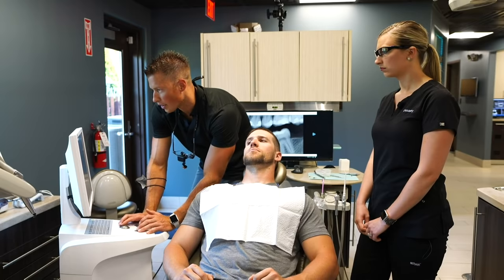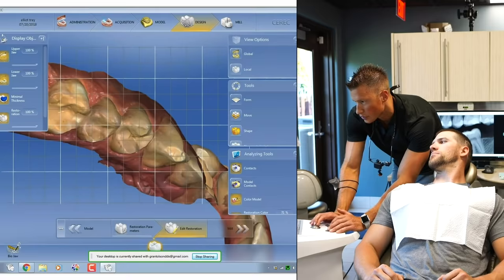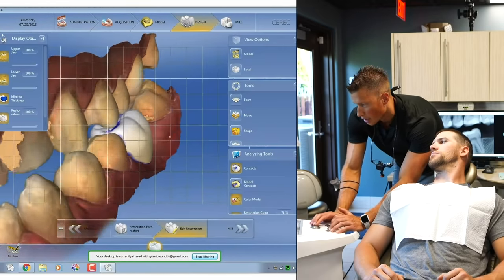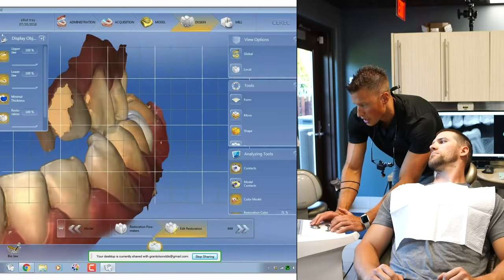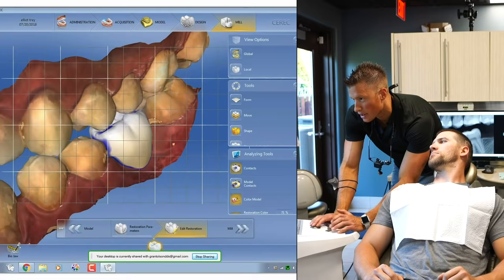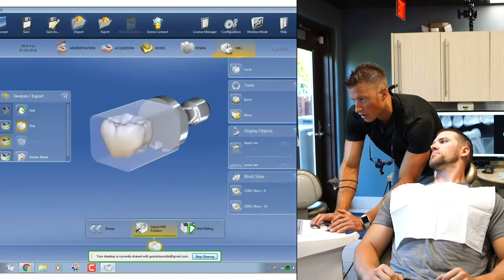So we've got a tooth now. Let's see how it works with your bite here, Trey. It works in the arch just fine, and down the road, it looks like it might work pretty darn well with your bite, right? So not bad at all. If that was your future tooth working on top of an implant, I think we could all settle for that being a pretty nice result. So that being said, we can go ahead and use that crown there to plan our implant.